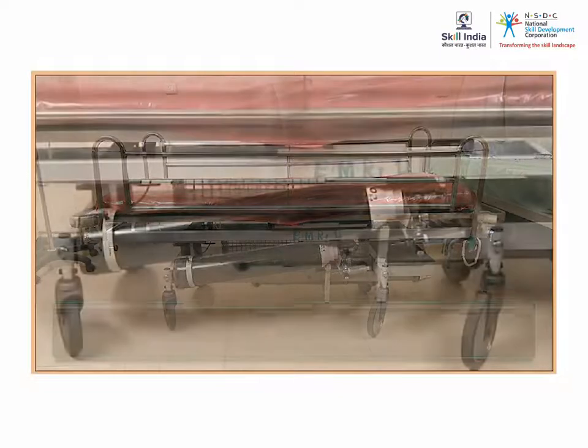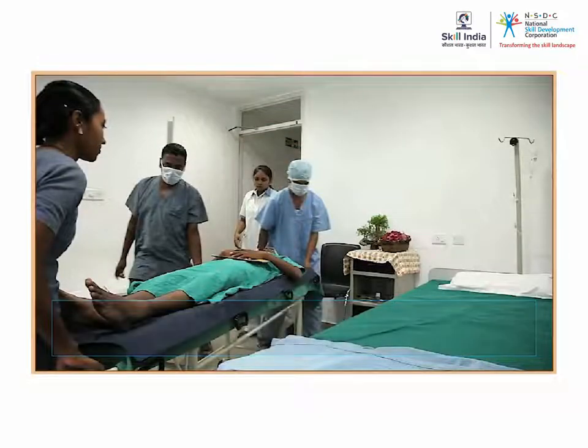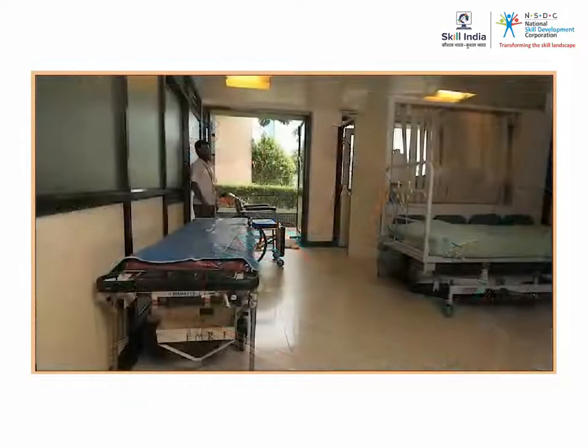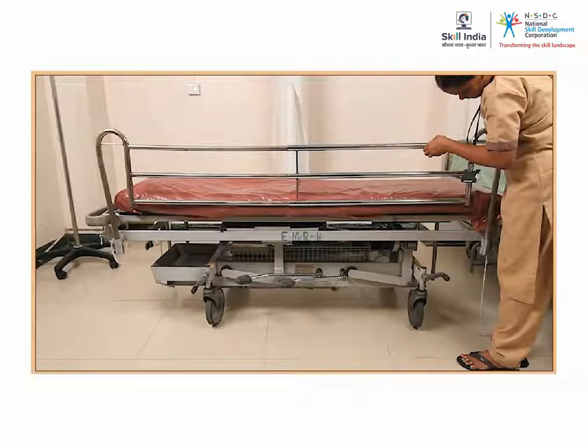The stretcher also has provisions for attachment of medication drips and carrying the support systems needed by the patient. The components of the stretchers vary from place to place, but you must be aware of the form and function of the stretcher that you would be using in your hospital.